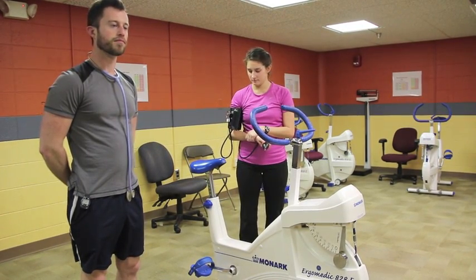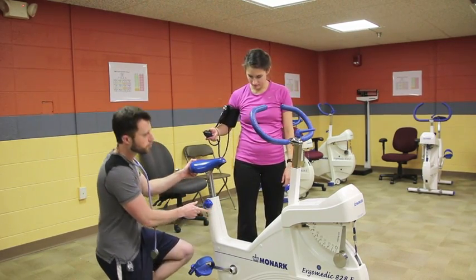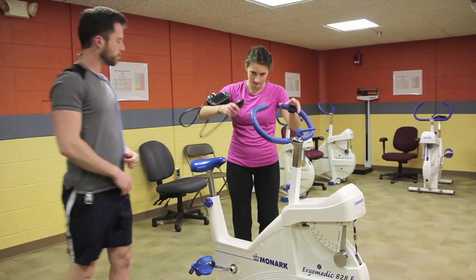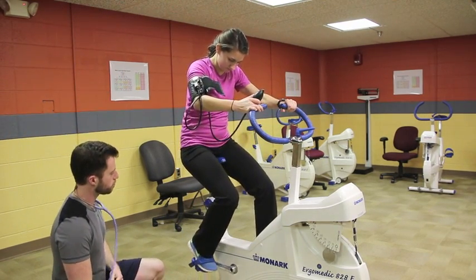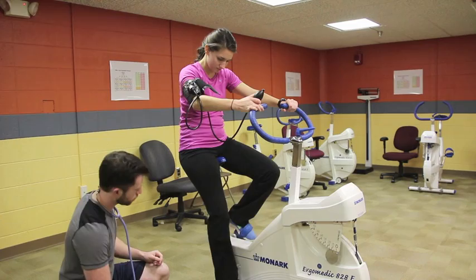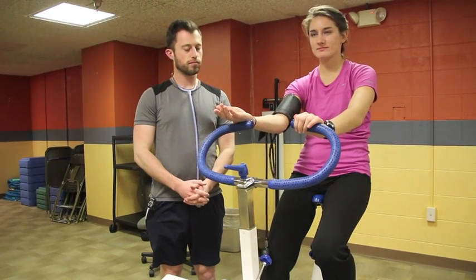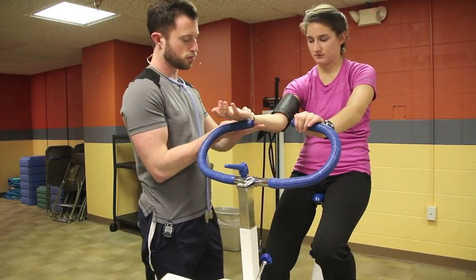Properly adjust the seat and handlebar height to the subject. With the pedal all the way down, the client's knee should be only slightly bent at about 5 degrees. Now collect the client's resting data: heart rate and blood pressure.